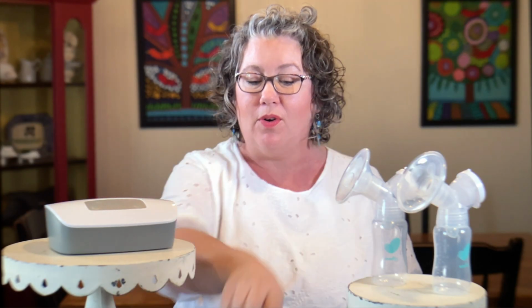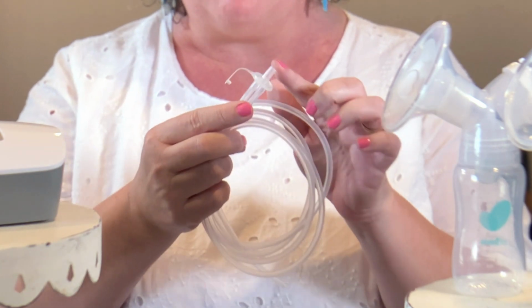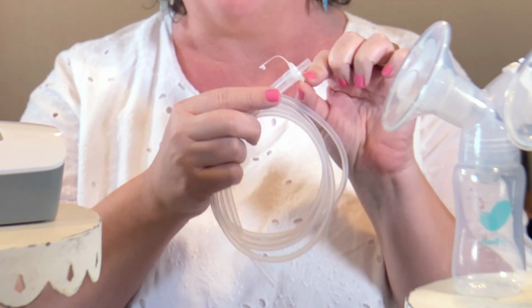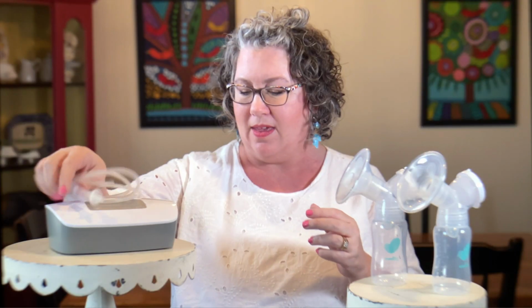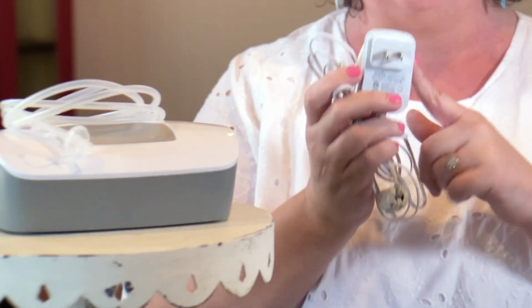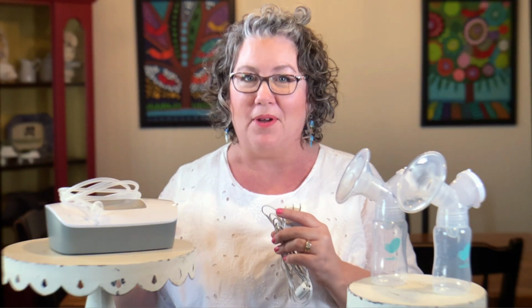In addition to the motor, you're going to find pump tubing. The end of your pump tubing has a tubing adapter already attached. This is the part that plugs into the motor. Okay, you're also going to find your AC adapter. This is the part that plugs into the wall when you're ready to use your pump.